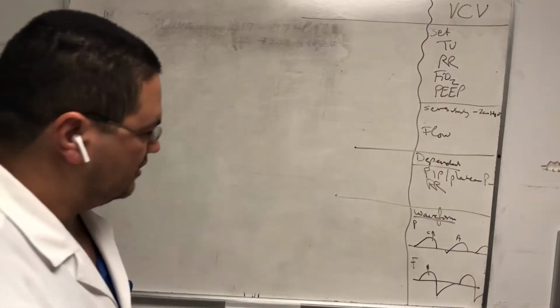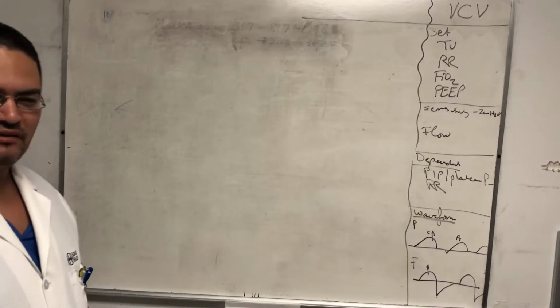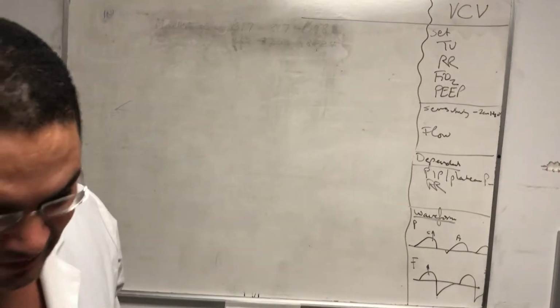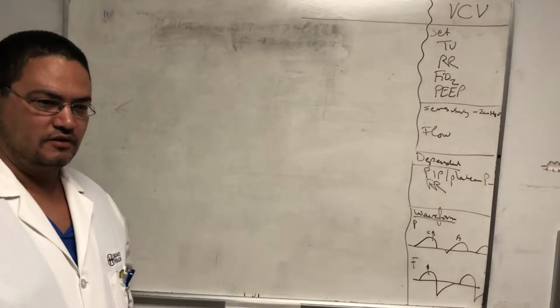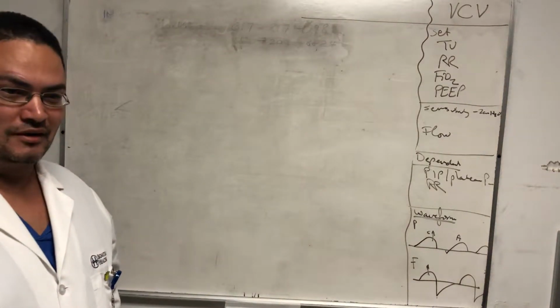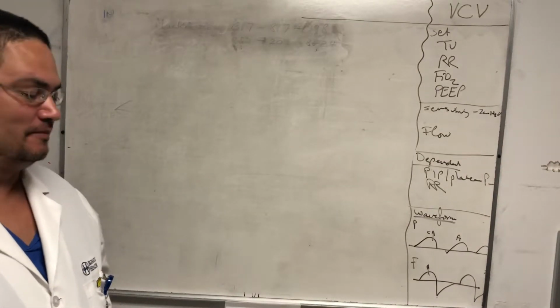When I was young, they used to say of COPDers, once intubated, always intubated. So don't intubate the COPD patients. But that was kind of weird. I never understood that 100% because why would that happen? Especially since I was doing my anesthesia residency. So that means if I intubate somebody coming in for toenail amputation, and I want to extubate him at the end of the surgery in half an hour, I can't? Something will change that much inside the patient? He won't be able to breathe on his own when he walked into the hospital?